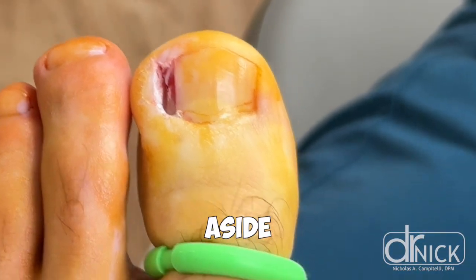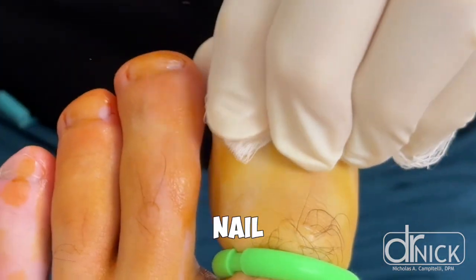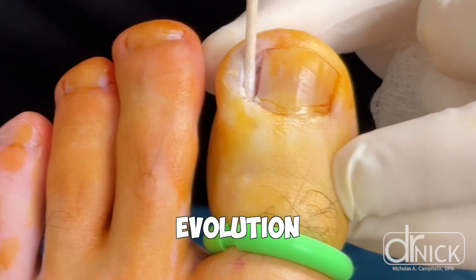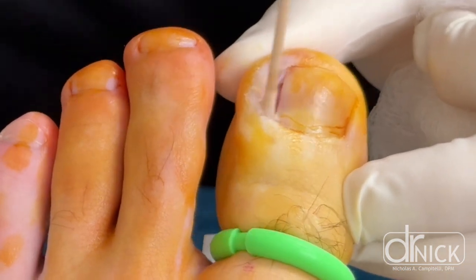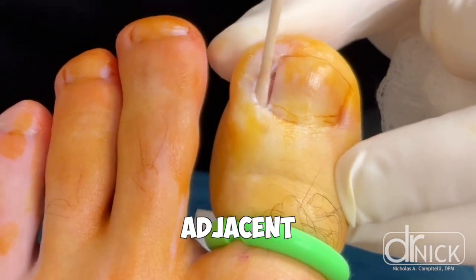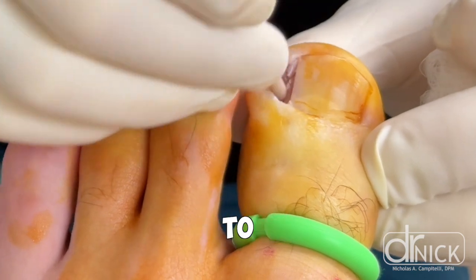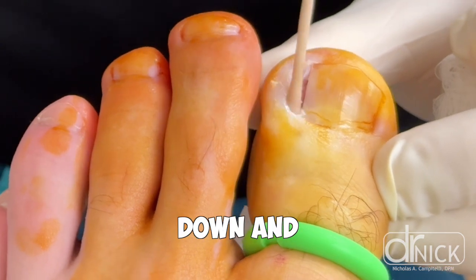So aside from a matrixectomy, the other option is to perform a nail avulsion where we don't put the chemical in. You can see we're using this cotton-tipped applicator now to insert the chemical. When we do a nail avulsion, we're not putting the chemical in — we're simply removing that border of the nail to let the infection calm down. You can see this patient had a swollen nail fold, which is the skin adjacent to the side of the nail that we removed. The infection creates this inflammation, causing the skin to swell.